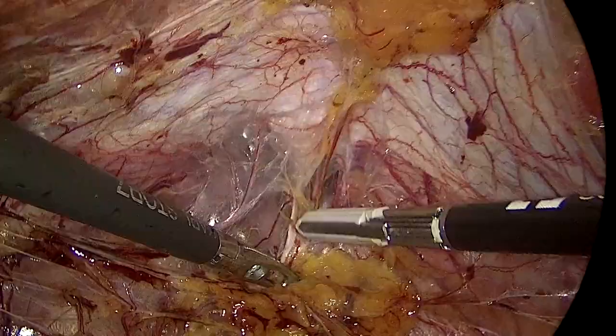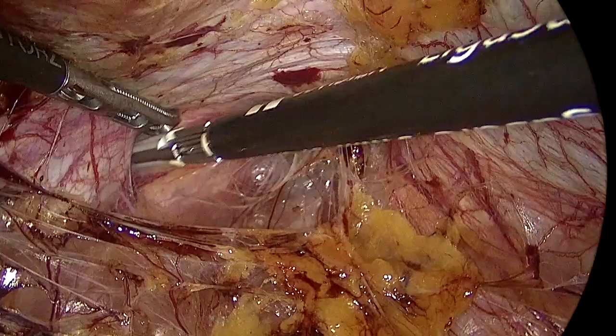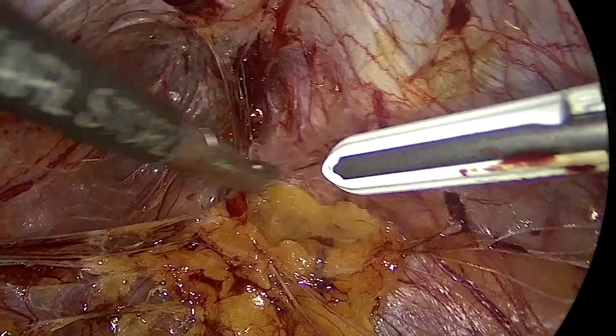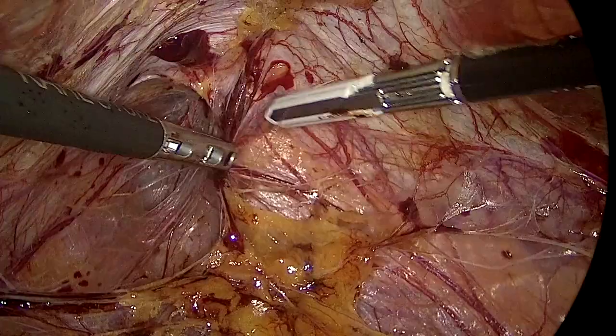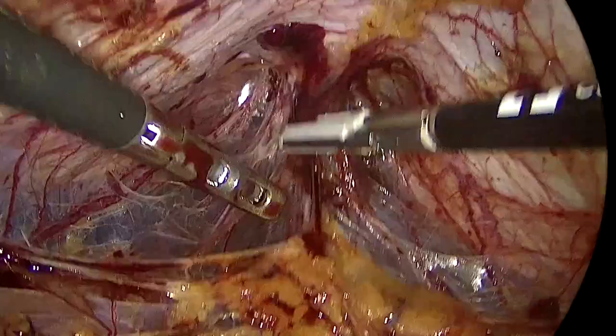I'm almost done with the dissection on zone 1 and progressing very nicely, but as I get higher and closer to the umbilicus, laterally the peritoneum becomes very thin. Despite me trying to handle the peritoneum with lots of care, I accidentally open it. This small rent caused a filtration of air into the peritoneal cavity.